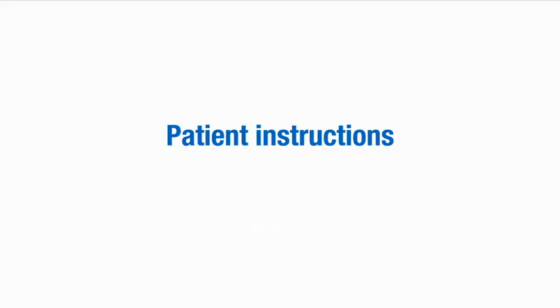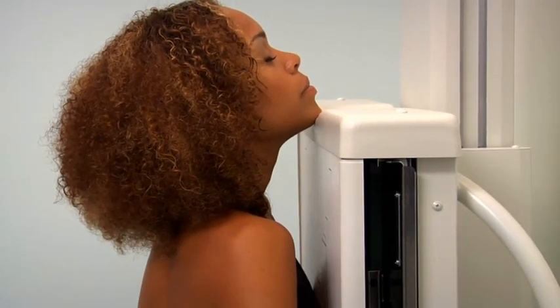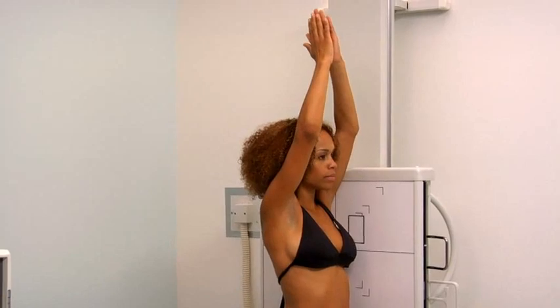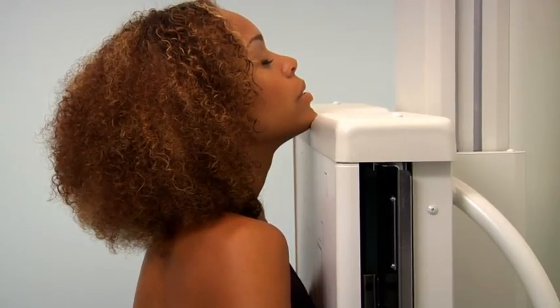It is important to provide the patient with clear and precise instructions. Patients may be given different instructions depending on the procedure requirements, such as remain still, breathe in and hold your breath, or put your arms up. If asking the patient to hold their breath, remember to inform them at the end of the exposure that they may relax again.